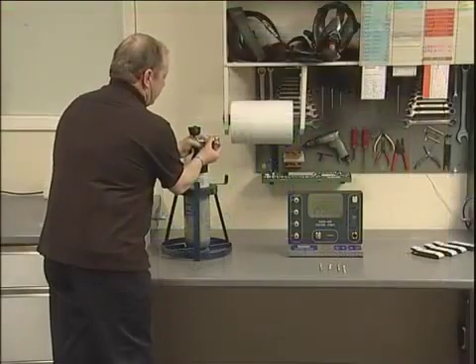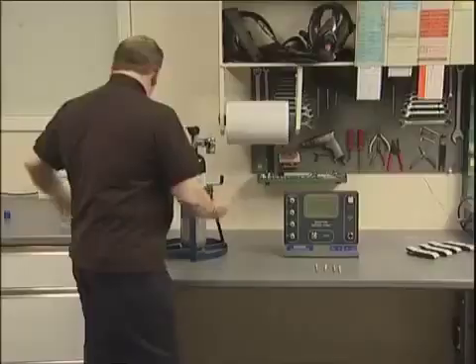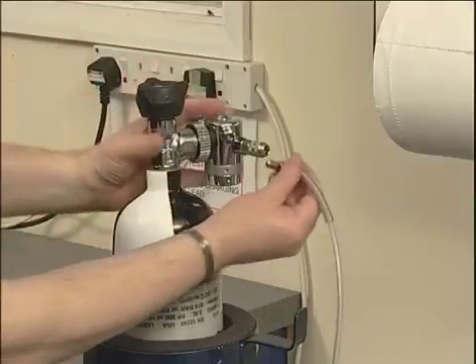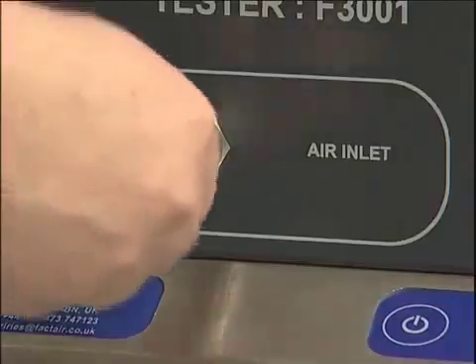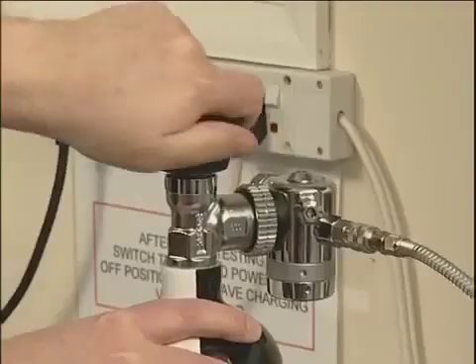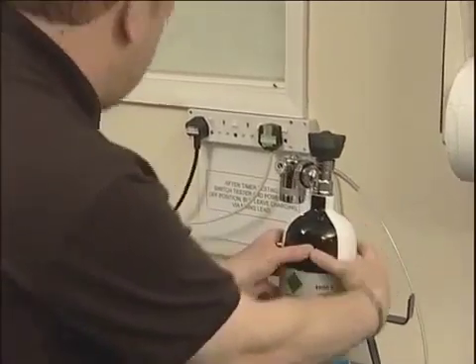Connect the high pressure regulator assembly to the cylinder to be tested, ensuring that the regulator has the correct type of connector for the cylinder. Connect the regulator hose coupling to both the regulator and the inlet of the tester. Open the cylinder valve and check that the cylinder is fully charged by reading the contents gauge on the regulator. A partially discharged cylinder can give an incorrect water result.